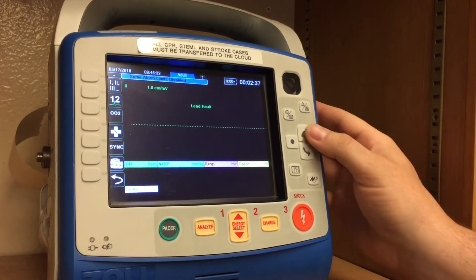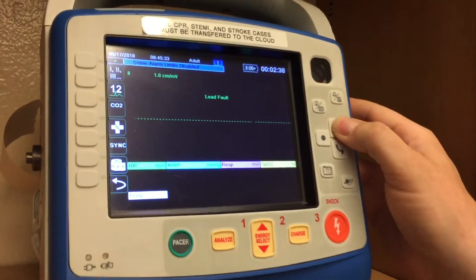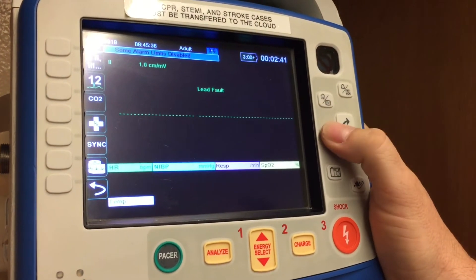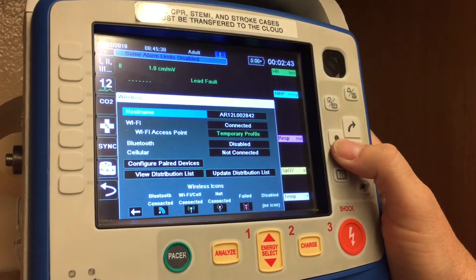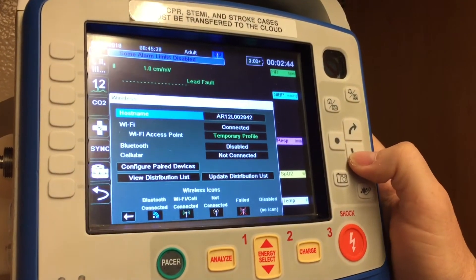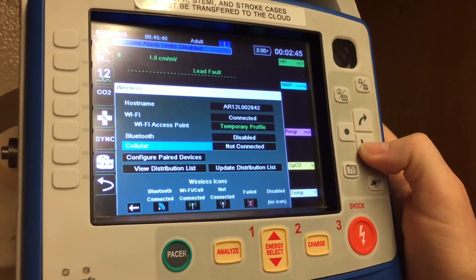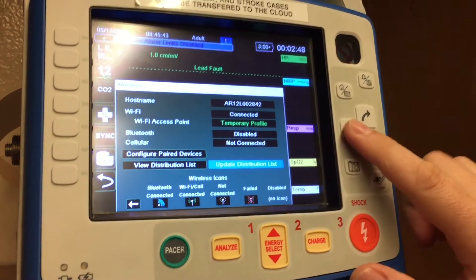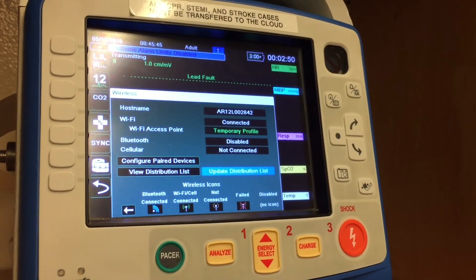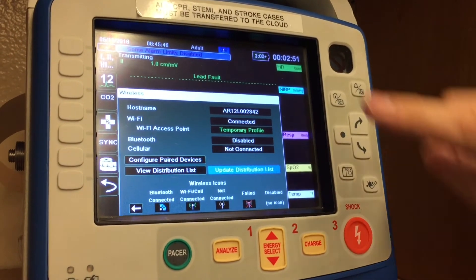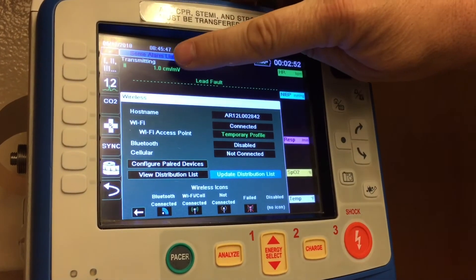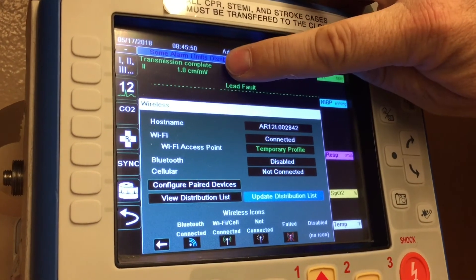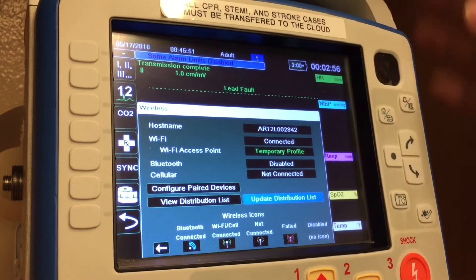All you have to do is go over to the Wi-Fi button — make sure you have a Wi-Fi connection, that's the first thing — and then go down to 'Update Distribution List' and hit that. It'll look for a signal and then it'll tell you the transmission is complete.